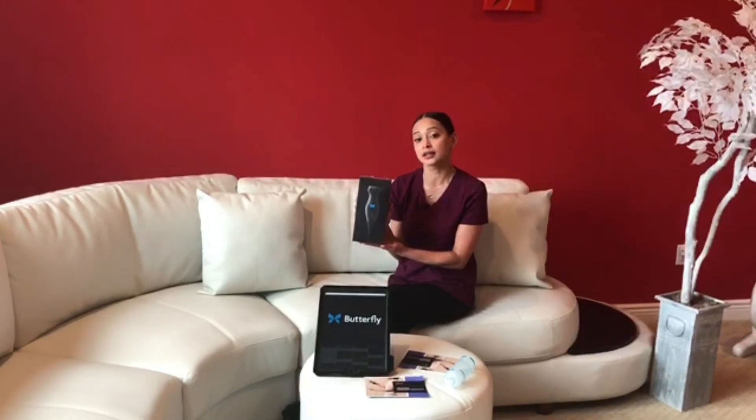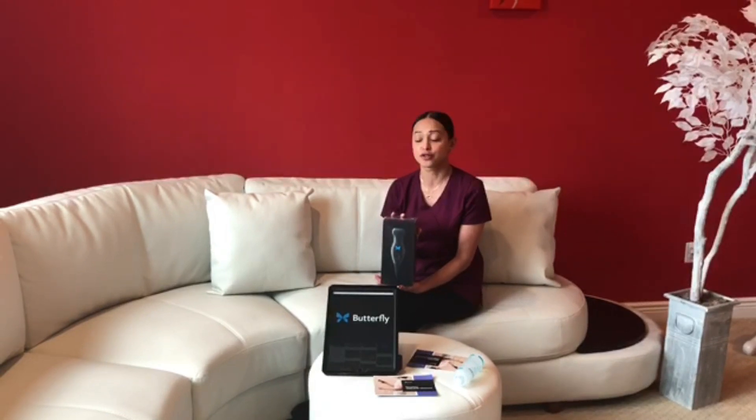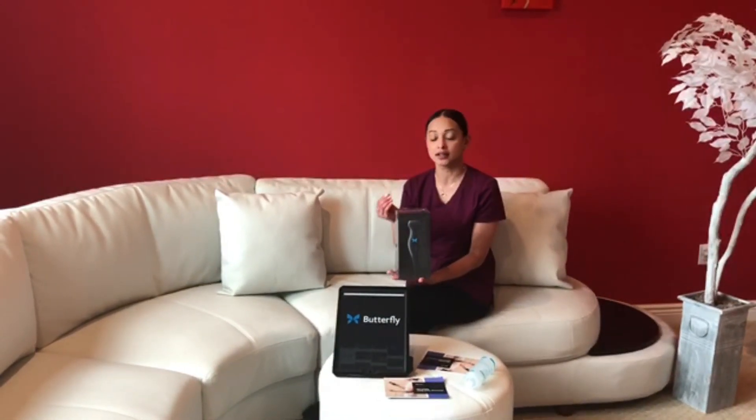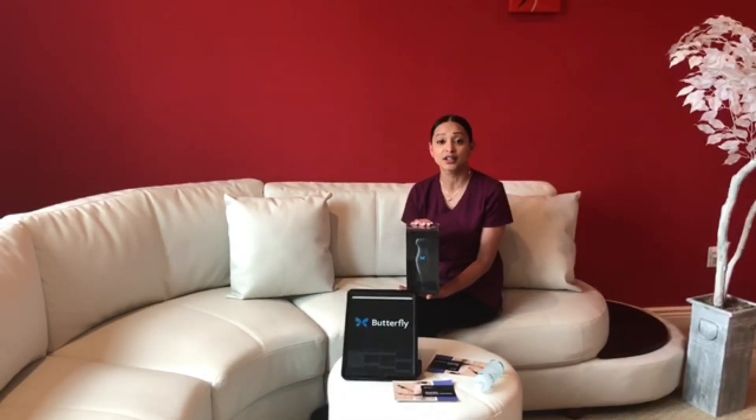What we're doing today is unboxing the Butterfly IQ, which is a new probe that just came out — I think they started distributing in October. What's different and revolutionary about this probe is that it can scan your entire body. You do not need to switch probes — from abdomen to a linear probe for vascular — it's everything in one probe. Basically what they did is they took everything and put it in a chip. Amazing technology.